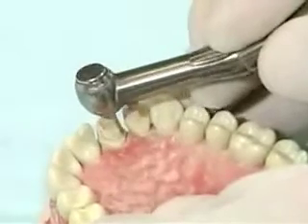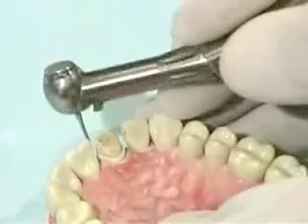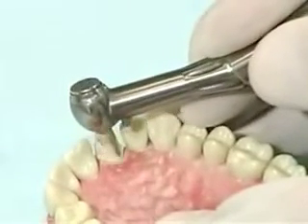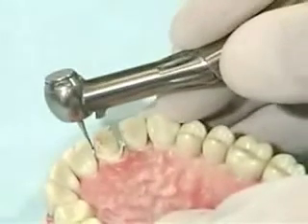Using the diamond burr, smooth and sharpen the edges of the preparation. Clean up any discoloration or burn marks left by the fissure and football shaped burrs, but be careful not to over-prepare the tooth.